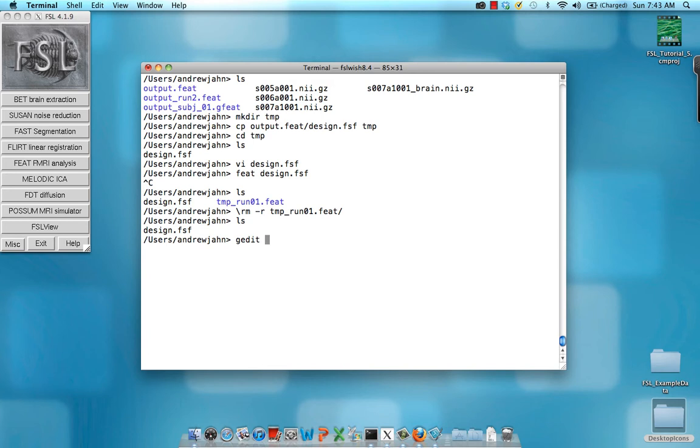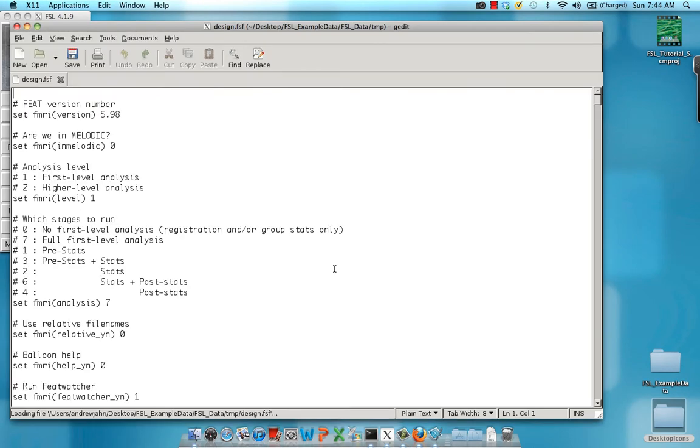But now if we want to make this more efficient and automate it, you can open up design.fsf with your favorite text editor, either VI, or in this case, I think gedit is also pretty useful. Just something that has a search and replace function.